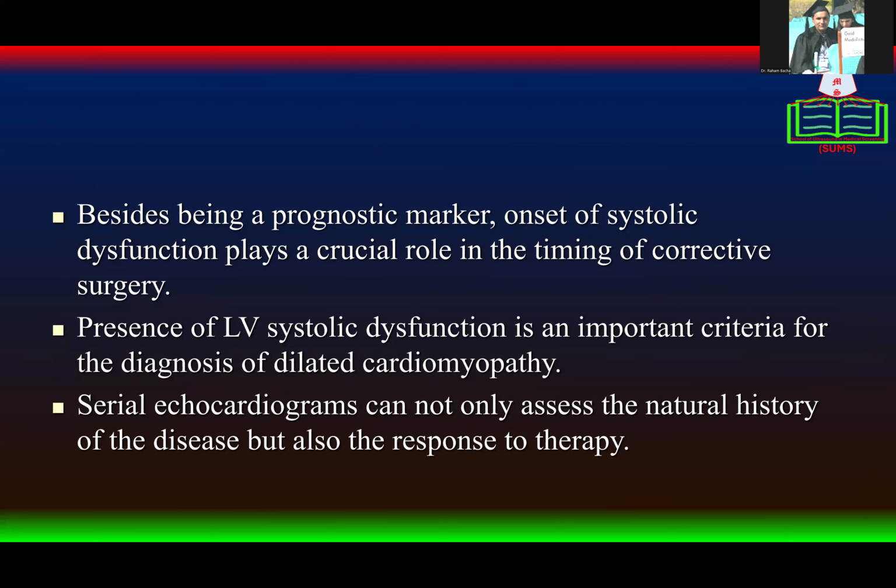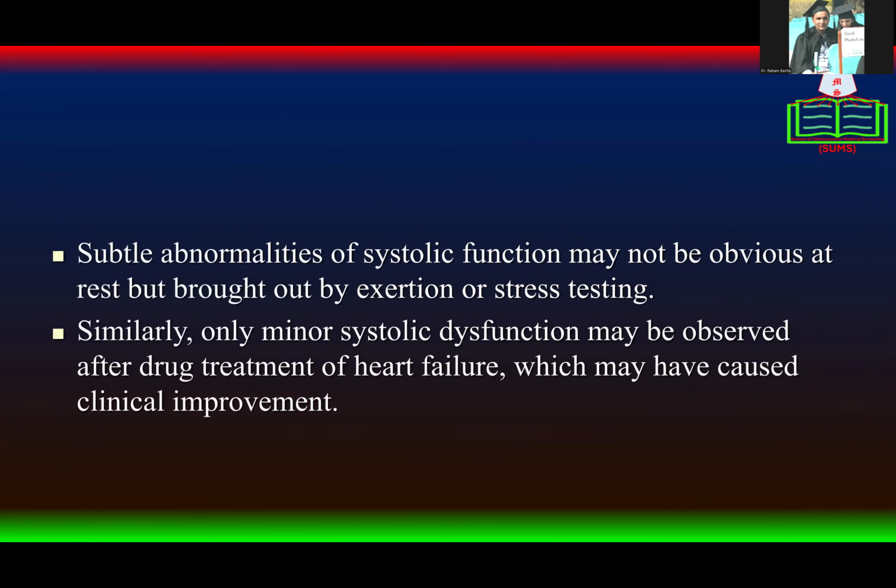Presence of left ventricular systolic dysfunction is an important criterion for the diagnosis of dilated cardiomyopathy. Serial echocardiograms can not only assess the natural history of the disease but also the response to therapy.